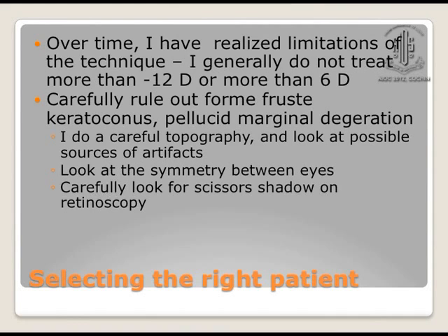And there are very good lens-based methods that are available today, including the ICLs, which you can use for these extremes of refractive errors that come your way. This is because of several reasons. If you try to modify the corneal curvature too much, and if it goes beyond the physiological limit, it's not going to remain stable any longer, and you would be surprised to find refractive outcomes which are not what you expected.